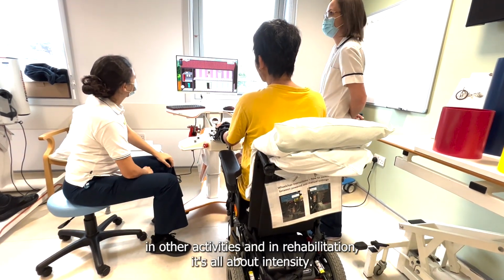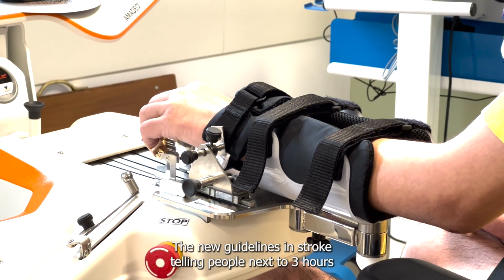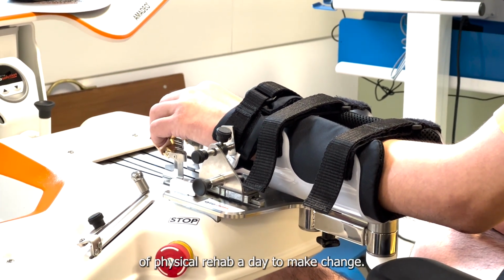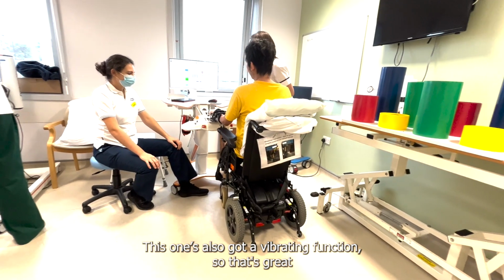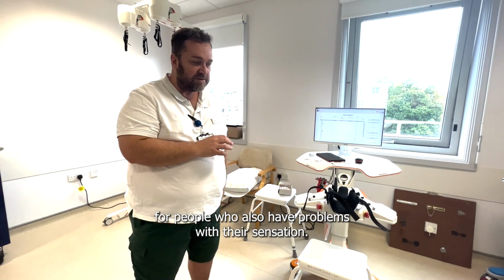And in rehabilitation, it's all about intensity. The new guidelines in stroke tell us people need to do 3 hours of physical rehab a day to make change, and these robots really help with that. This one's also got a vibrating function, so that's great for people who also have problems with their sensation.